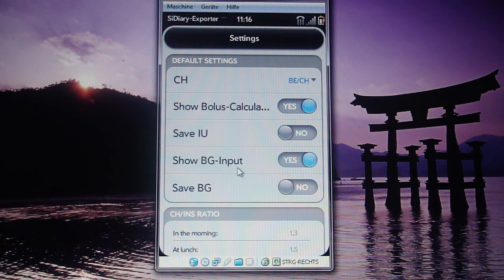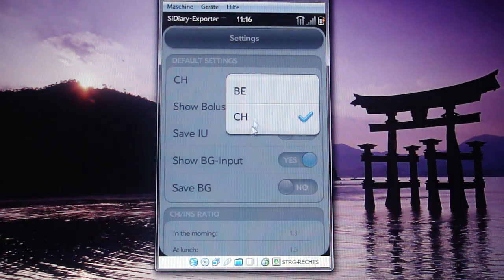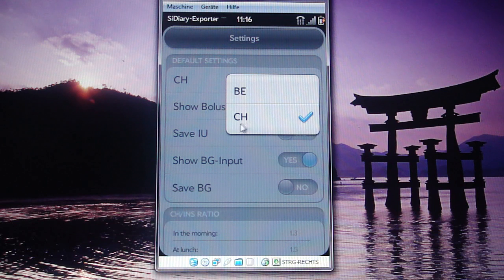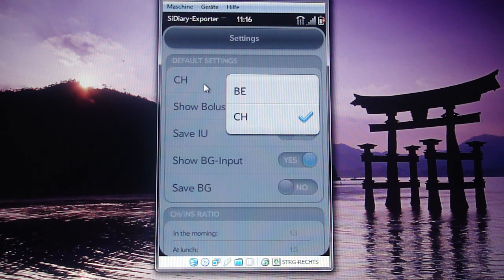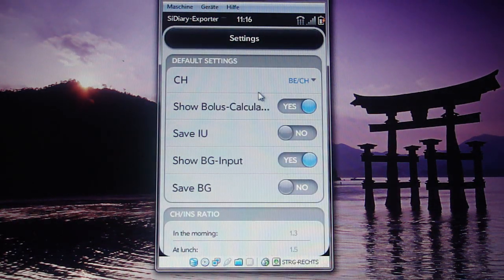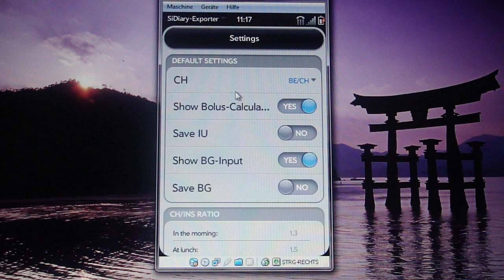When you start the program for the first time you will see the settings screen, and I'll explain what all these settings are about. The first setting is where you can select what kind of information you want to save per default in your profile when you eat something — whether you want to save the carbohydrates or just save the BEs instead. You can enter either BE or carbohydrates in the input screen; this only affects what kind of information is saved. If you enter a BE value, it will automatically recalculate it into carbohydrates and save it.